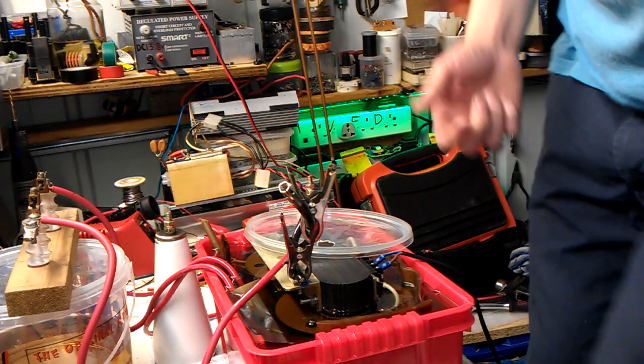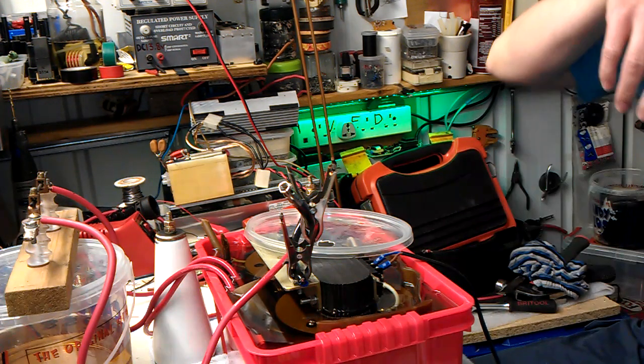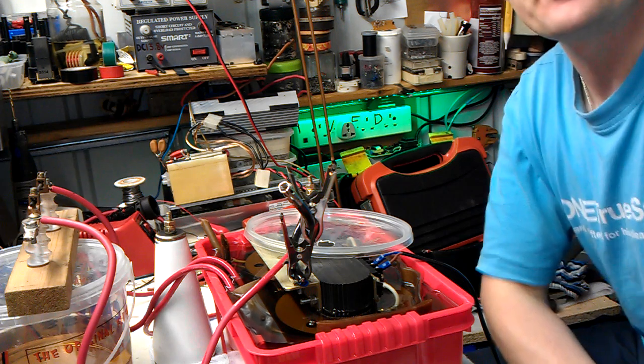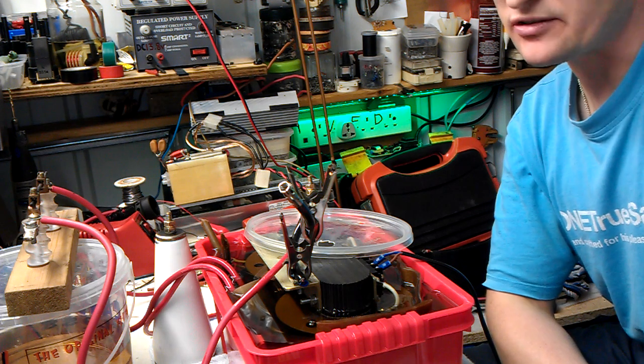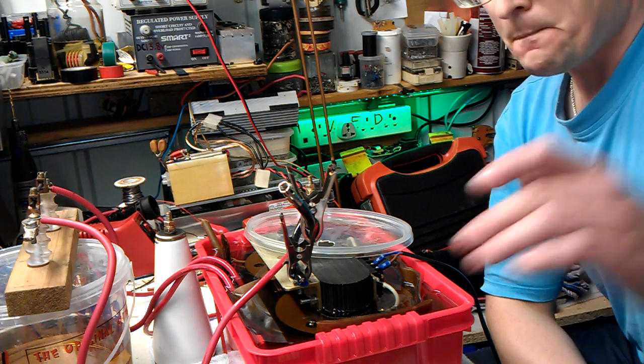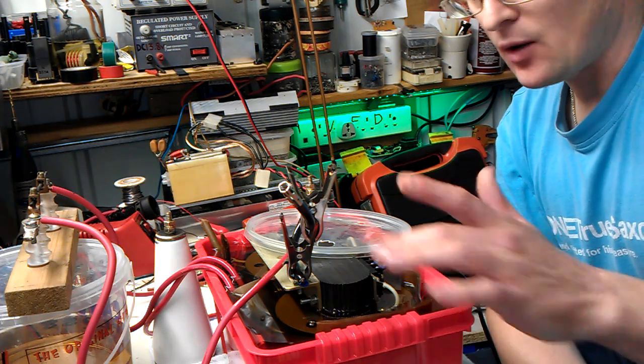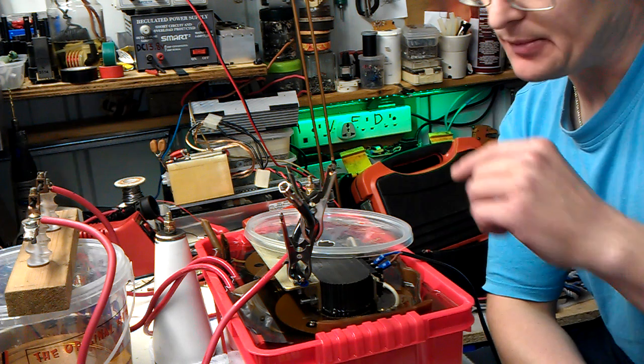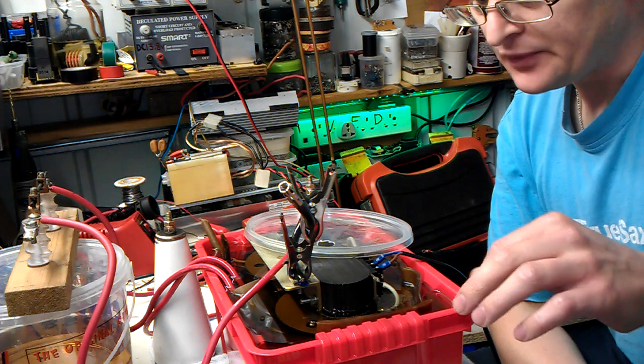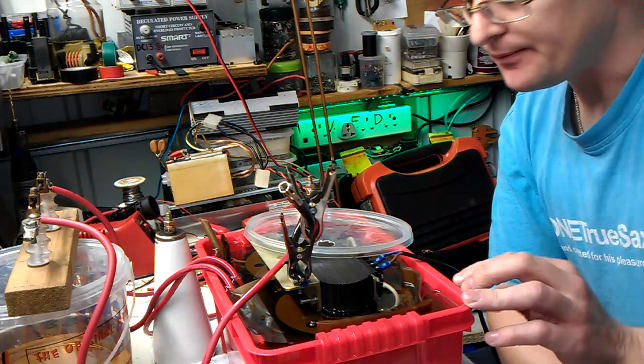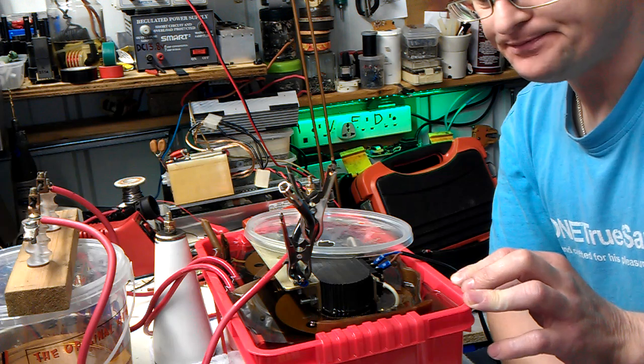OK then guys, this is the third video of the autopsy of the X-ray transformer. This is now in dielectric oil. Excuse the dogs in the background playing.